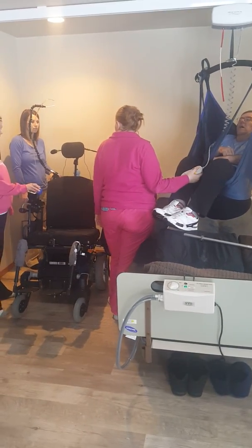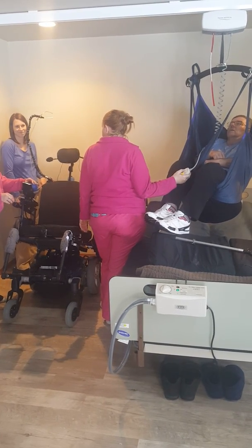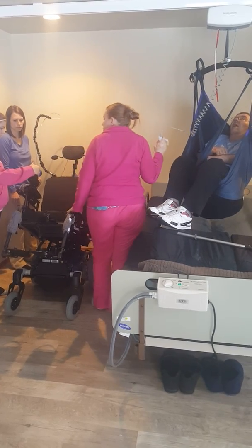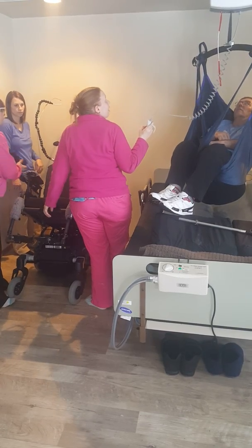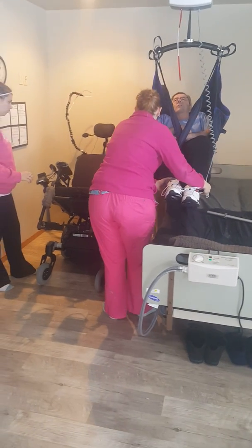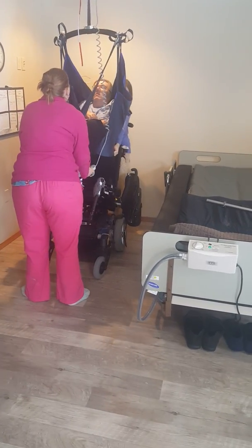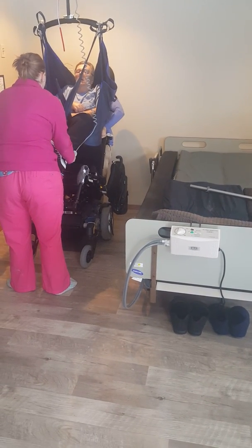He was already standing? I thought it was one o'clock he said he'd be here. No, noon — you said one yesterday. Well, I was planning one, but then Kim wanted to do range with me. For the video — always look at the body, it's a lot easier. They just video the girls doing this. We already got it down pat, we don't have to. I do not like this one. No, I don't either.